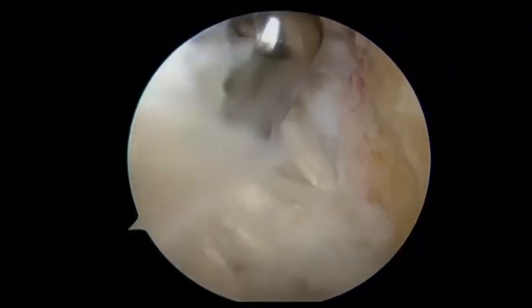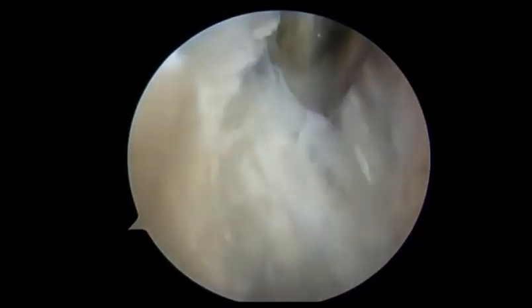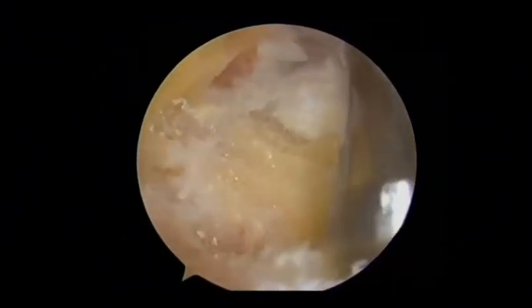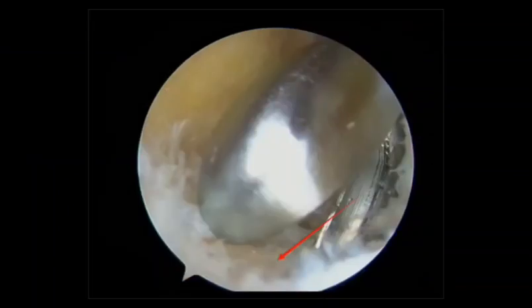During the debridement of the calcification, it is crucial to continuously pay attention not to damage the surrounding white areas. Once normal patellar tendon tissue deep to the calcification is exposed, further debridement should not be continued. Following this, the calcified lesions on the upper surface of the junction between the patellar tendon and the tibia are cleaned by shaver, and a small amount of diseased patellar tendon and calcified material is taken as a pathologic sample.